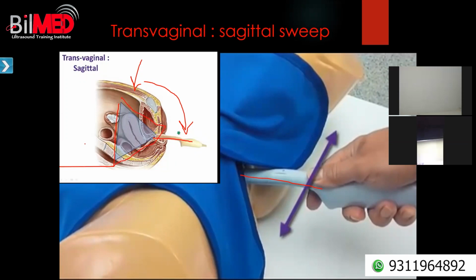Sir, please repeat. How will the probe be moved, this way or this way? I mean, see my hand, this way, right to left, or from top to bottom, being in longitudinal section. In longitudinal, from up to downwards? No. From anterior to posterior? No. No.